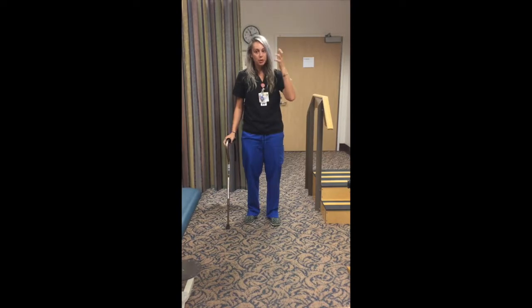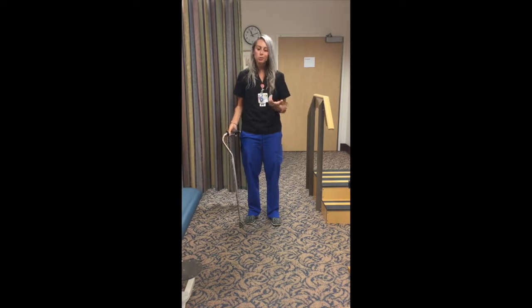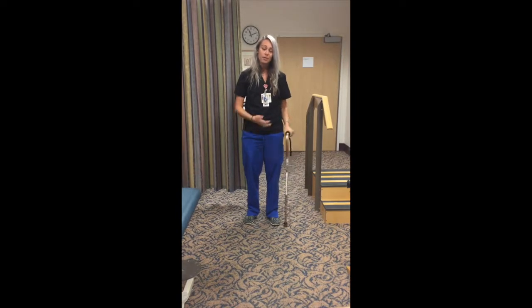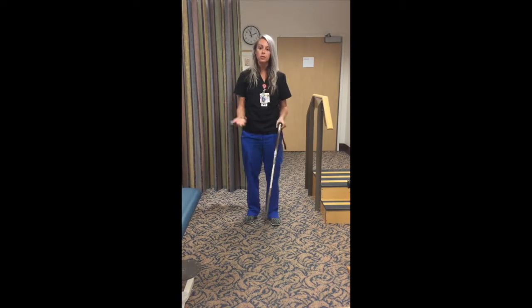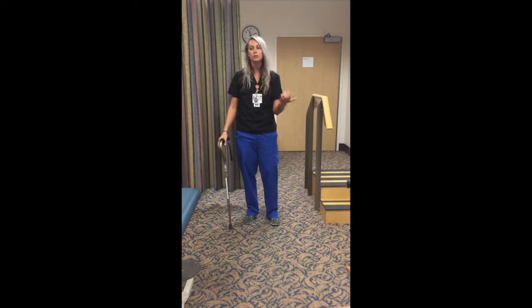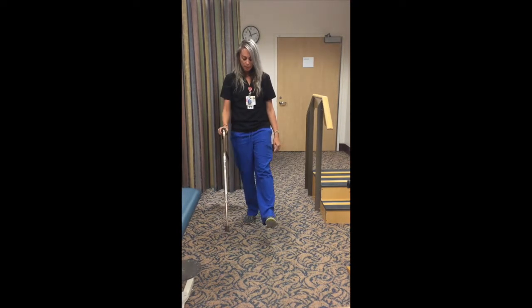Now, if I'm left-handed, this is going to feel really awkward at first. But you're going to have to train your brain to teach your body that this is the correct way to do it. It's much more harmful to hold it on the wrong side. If you're trying to learn to walk correctly after you went through all the surgery and therapy and training, it's worth it to keep practicing with it until you get comfortable. So if this is my operated side, I'm going to hold my cane on the opposite side.